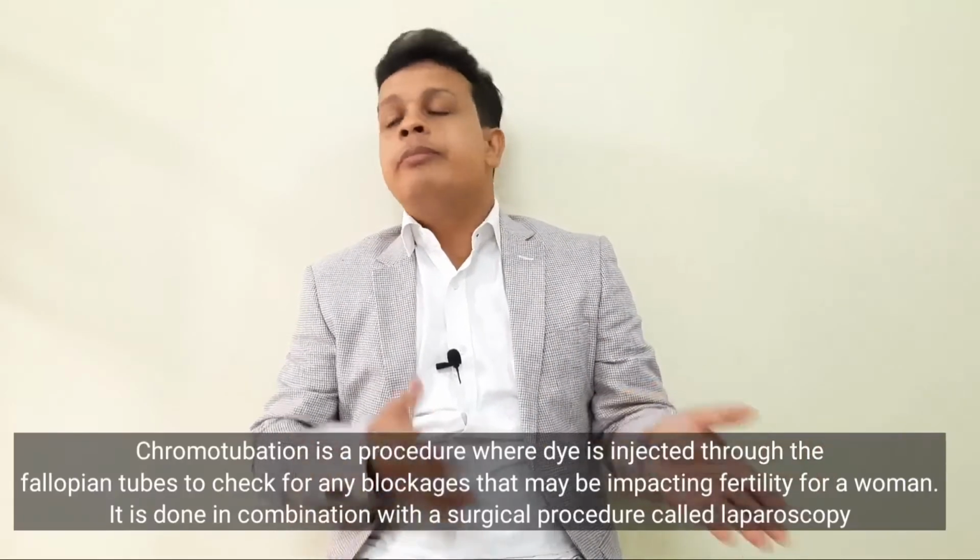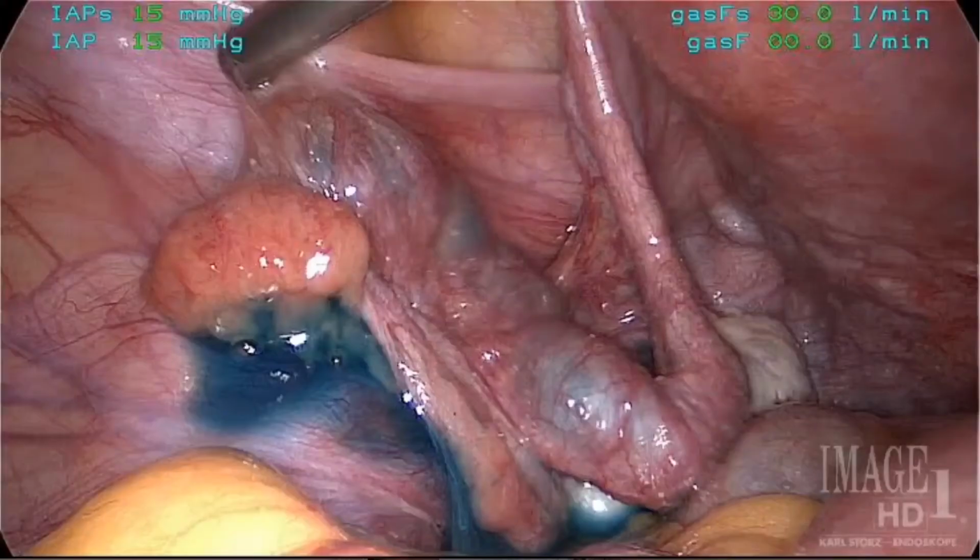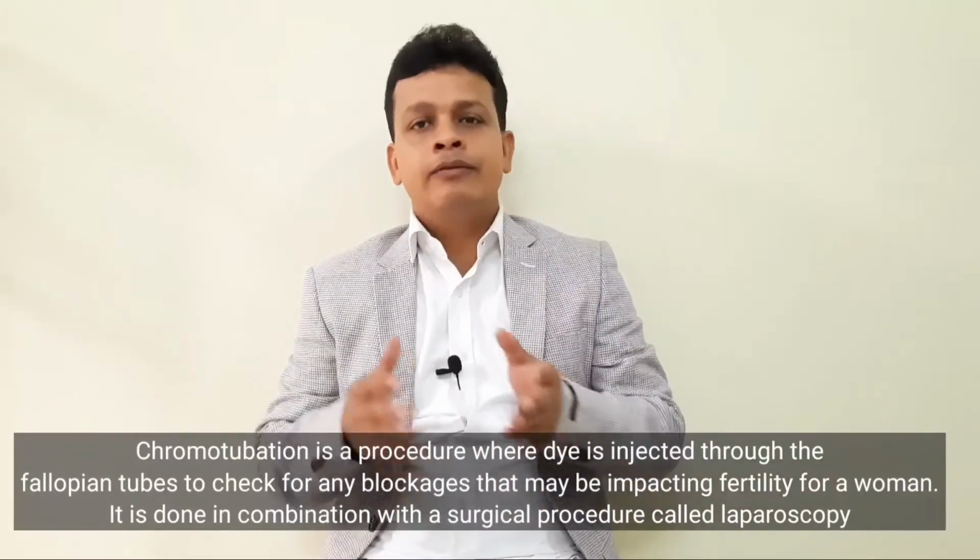But the lumen of both the fallopian tubes cannot be seen by laparoscope alone. Here you need to do a procedure which we call laparoscopic chromopertubation, maybe with the help of hysteroscopy also. In this small procedure, we give a dye through the cervix, it goes into the endometrial cavity, and if both the ostia as well as the lumens of the fallopian tubes are patent, then spillage of the dye from the lumen of both the fallopian tubes is seen in the peritoneal cavity, and that can be witnessed by the laparoscope. So this is what we call laparoscopic chromopertubation.